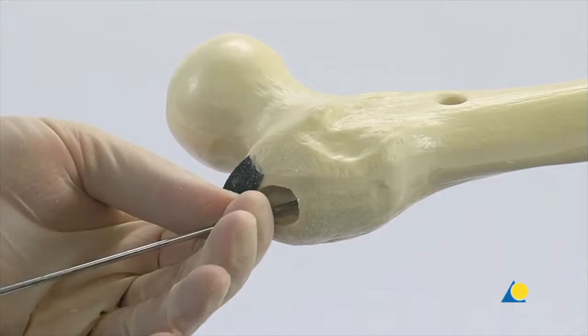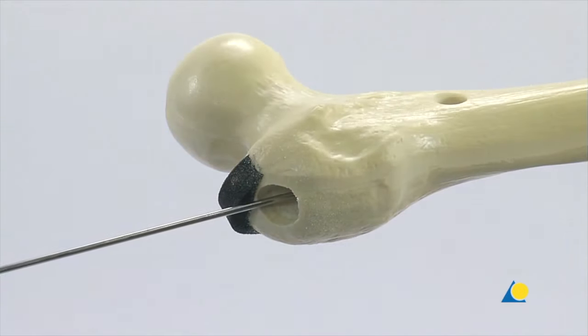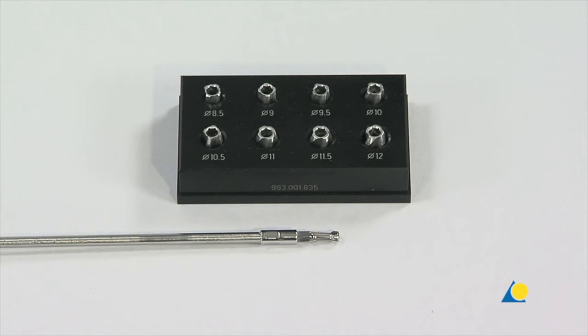The universal chuck is now removed. The reaming instruments consist of a flexible shaft and a set of reamer heads. These reamer heads have diameters from 8.5 up to 12 mm in 0.5 mm increments. Since a 10 mm diameter nail will be used in this exercise and the medullary canal is normally reamed 1 mm greater than the diameter of the nail, the medullary canal will be reamed to a diameter of 11 mm.